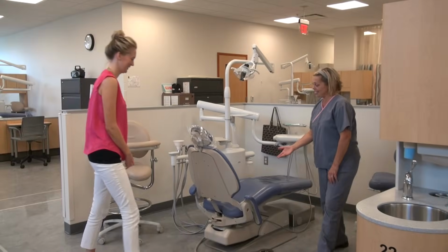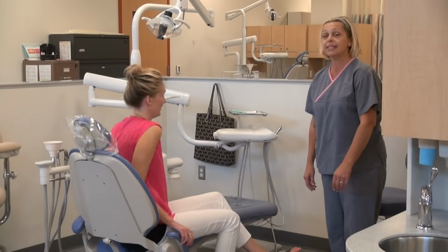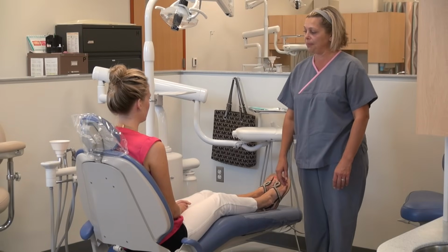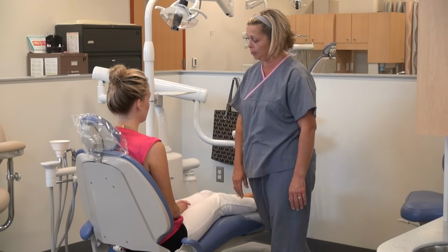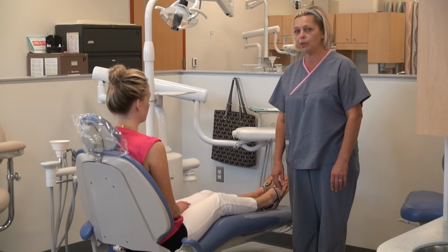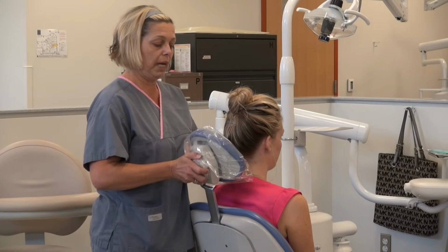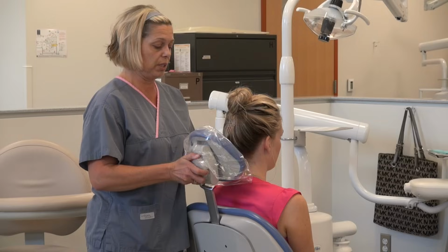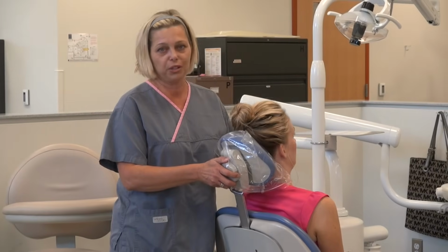All right, I'm going to ask the patient to sit down with her bottom all the way back in the chair and to sit up nice and tall. This is good ergonomics for the patient and the dental team. The dental chair will be able to support the patient's lumbar and relieve pressure from their knees at the knee break in the chair. At this point, you want to adjust the patient's headrest. Move the headrest up and adjust it so it supports the patient's head in the occipital region. Rest your head back. The operator will make final adjustments prior to the procedure.